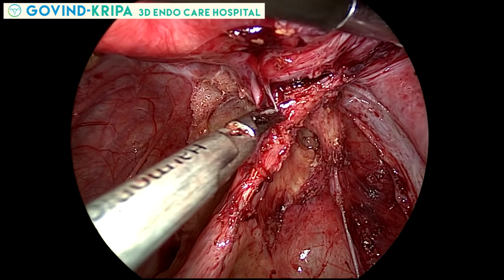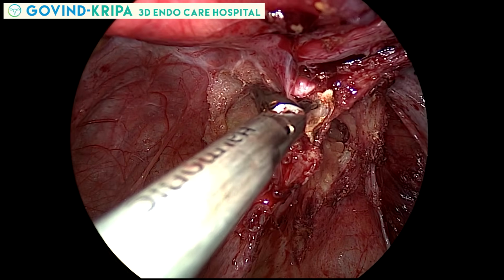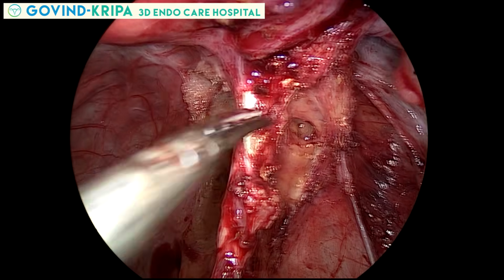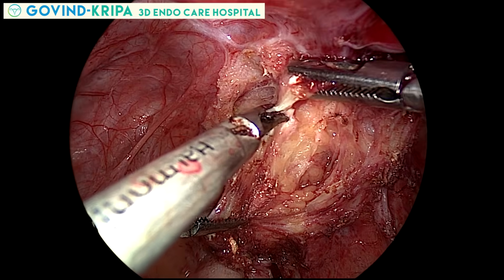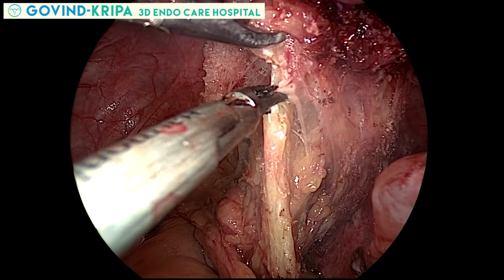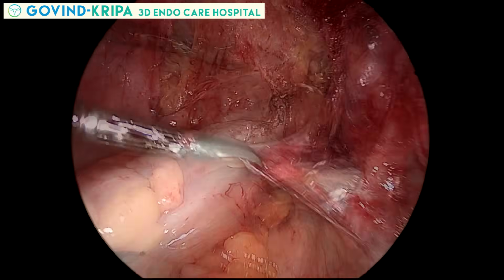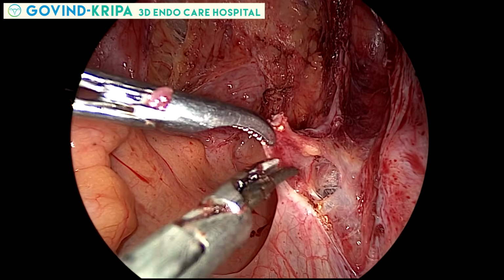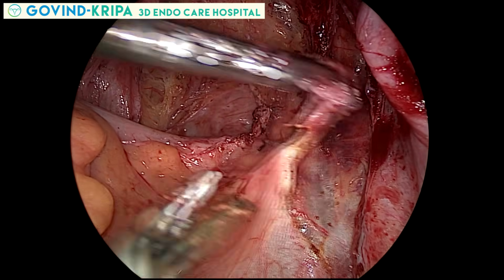Now rectum is released completely to enter into the rectovaginal space. Inflamed uterosacral ligament is cut excised after safeguarding the ureter and the inferior hypogastric nerve.